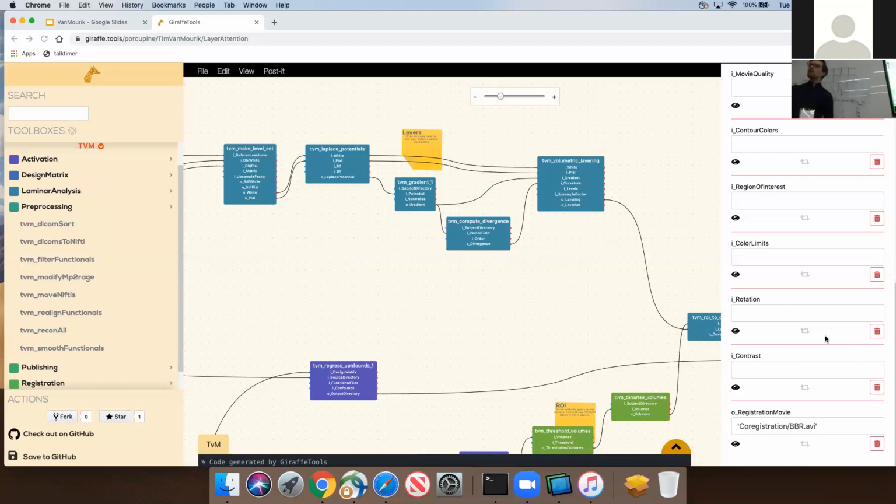Well, you already gave a potential solution. This is a very simple formulation. What you could do is try and add more prior information to the system. That can be something about the spatial homogeneity. You mentioned something about regularization terms. Those are all ways of optimizing spatial regression like this. So I'm not saying that it's impossible. I am saying that I tried some of these and we didn't have a lot of luck. If you have suggestions, then I'd be happy to hear them, but also please feel free to try it out.